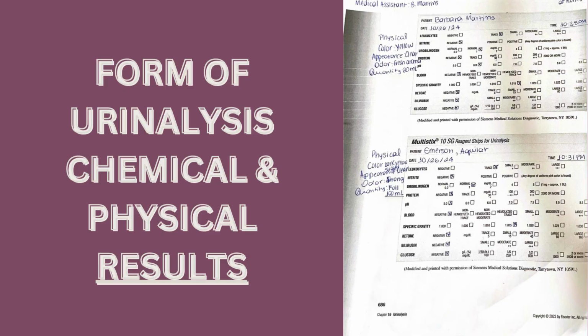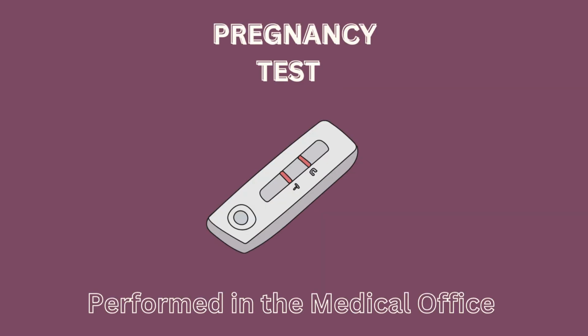Pregnancy test relies on the presence of HCG, or human chorionic gonadotropin, for a positive reaction. HCG is produced by the developed fertilized egg and small amounts are secreted into the urine and blood of pregnant women. As we know, medical assistants are responsible for performing a urine pregnancy test in the medical office.